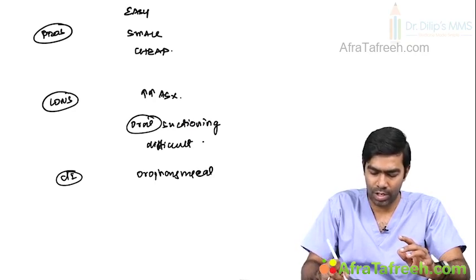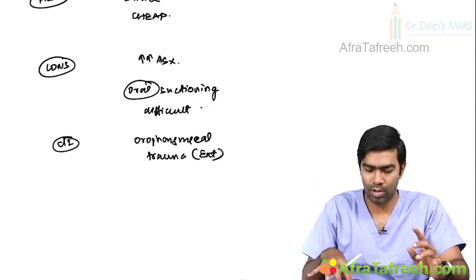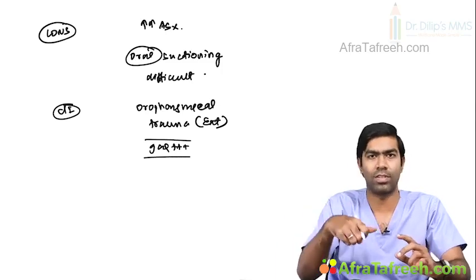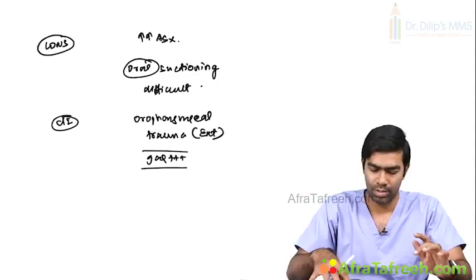I mean, only a relative contraindication: extensive oropharyngeal trauma, especially if you cannot see where the mouth and the tongue are. And if the patient has a positive gag reflex, it is very difficult. In the presence of a gag reflex, if you insert it, they will vomit and aspirate the contents again. Definitely don't do it.